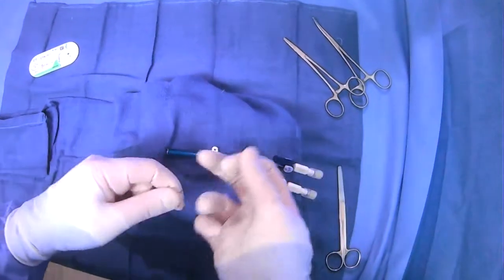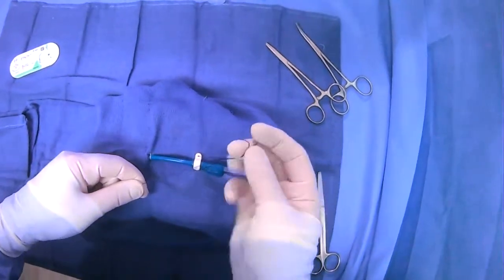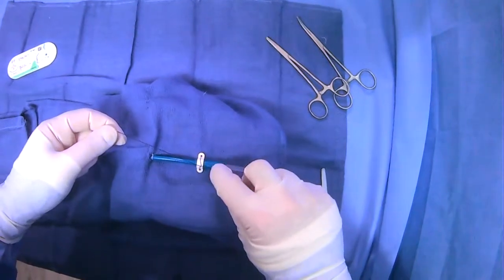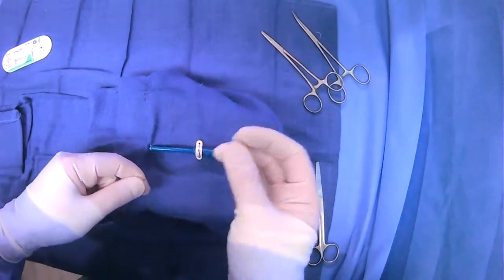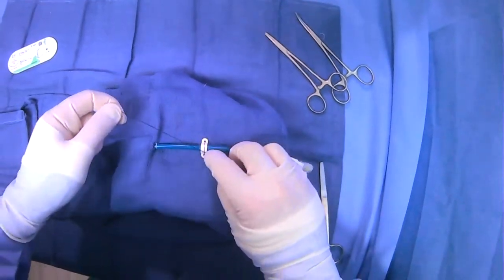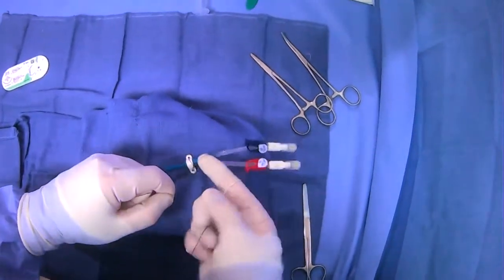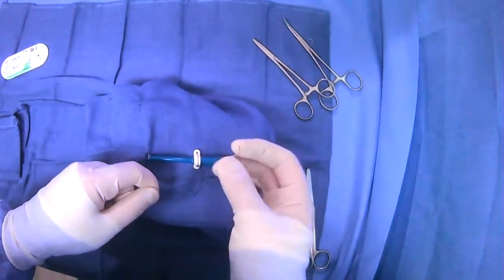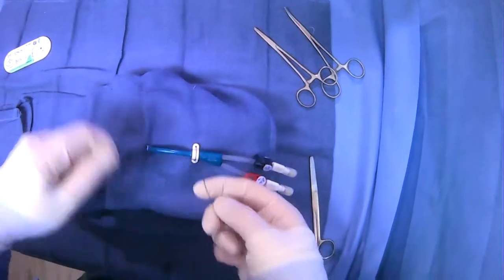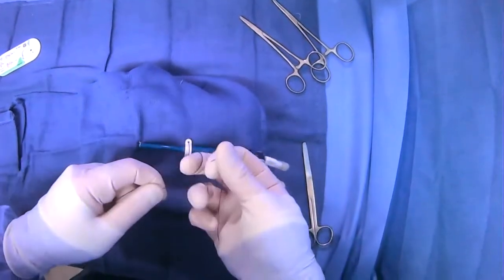Now you have a very easy setup to just suture. At this point you don't really have to worry about air knots or anything like that. You can suture it pretty tightly if you want to, because it'll be easy to cut based on the shape of this apparatus. You don't want to overdo it, but this is the advantage of doing it this way — some people think it just sits a little more nicely against the skin, because you don't have to deal with making two air knots. You just have something that's pretty flush.